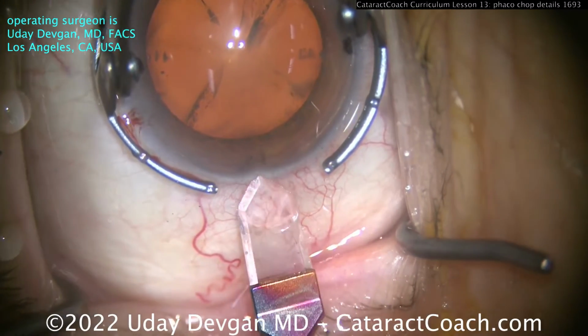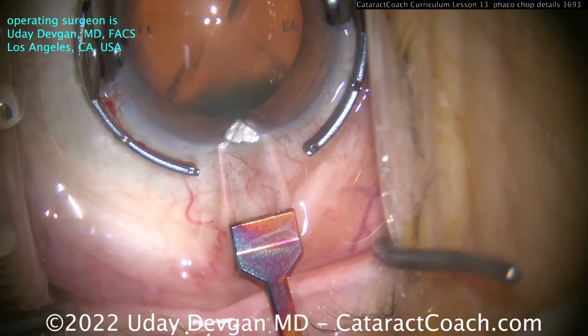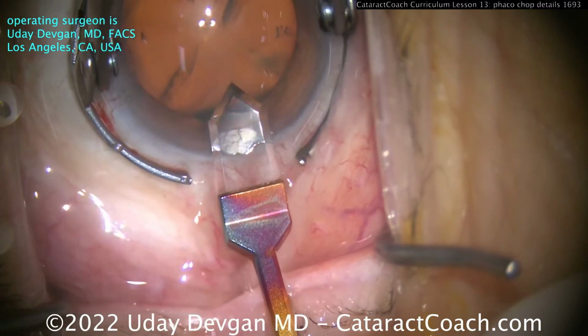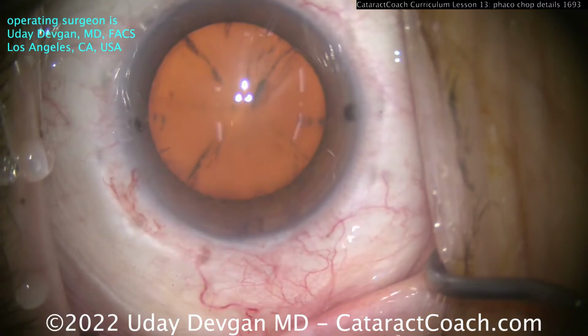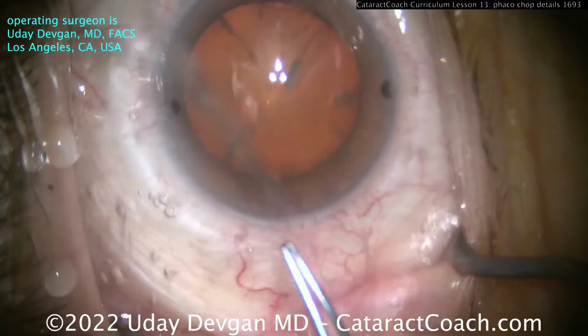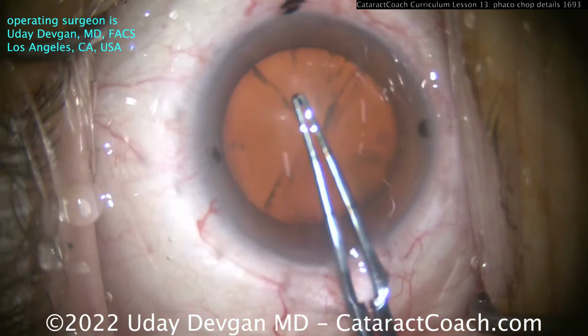The first thing we're going to look at is the nuclear density. So this patient has a typical nuclear density for our Beverly Hills clinic. And if you look here, that's about 2+ nuclear sclerosis, maybe 3+. And this technique of just one chop works great for that density of nucleus.